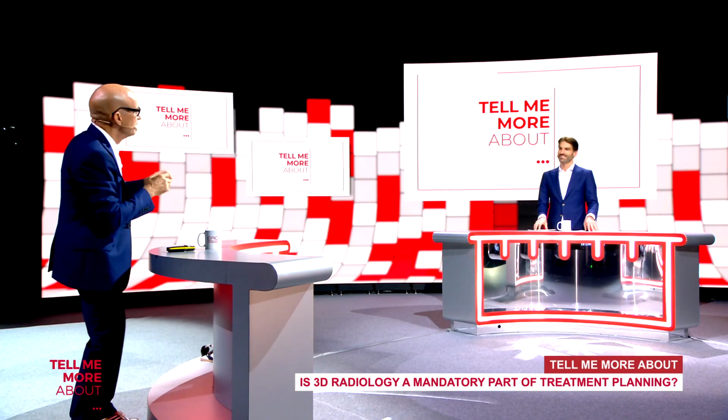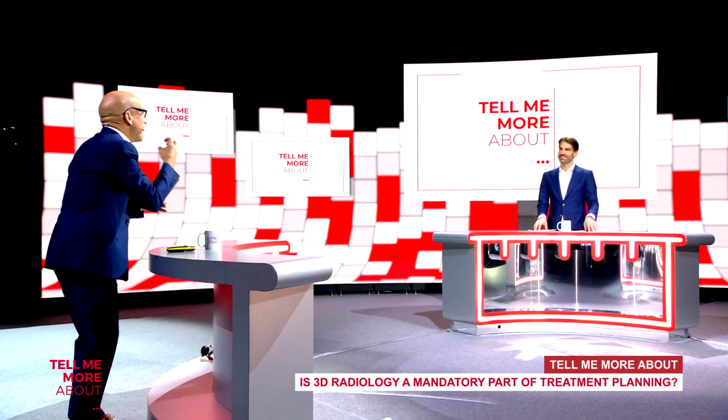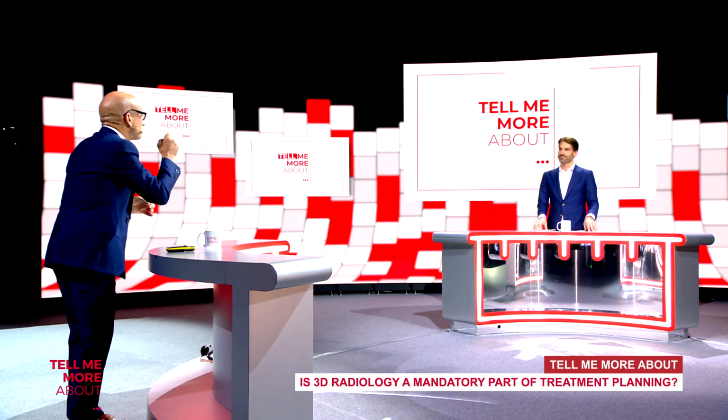When you do the socket shield procedure, you have to design it three-dimensionally, and then you have to find ways, and that's the trick, to anchor your shield with the thread, and then it becomes a much safer treatment. Exactly. So there is a typical example where I would never renounce a 3D radiograph. This is mandatory.